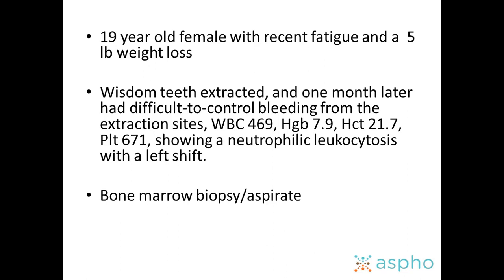germline syndrome. This next case is a 19-year-old female with recent fatigue and a 5-pound weight loss. She had her wisdom teeth extracted and 1 month later had difficult to control bleeding from the extraction sites. She has a white count of 469,000. I got an urgent call from the emergency room: come in and do flow cytometry on this patient.